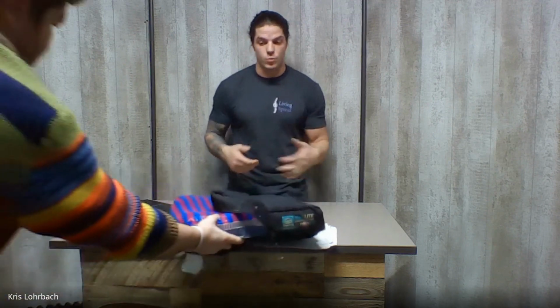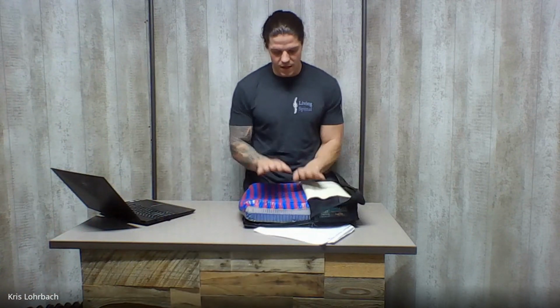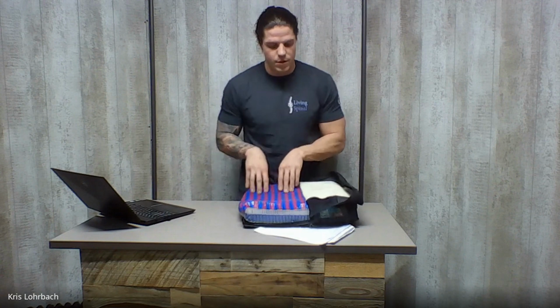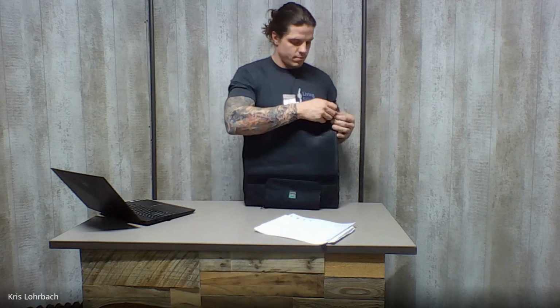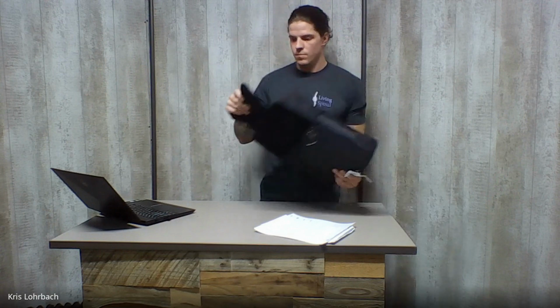It's good for pressure sore people because a lot of times people, especially incontinent people, have a big concern with pressure sores. Urine really advances skin breakdown. So a cushion that can prevent heat and moisture as much as possible while also being able to redistribute your pressure is important. These cushions feel stiff. Yes. Okay, they feel firm. They are a bit firm, but with firm comes support.